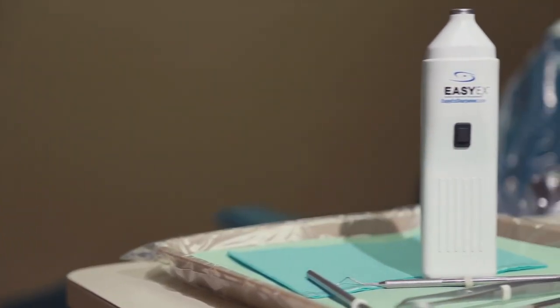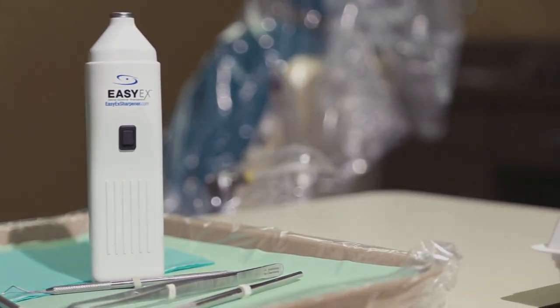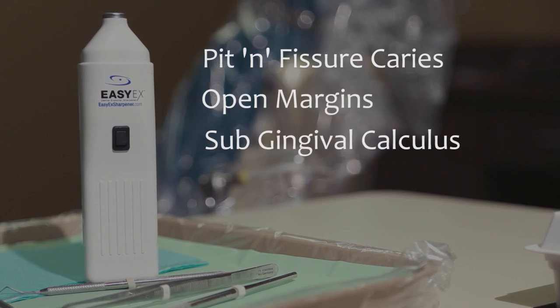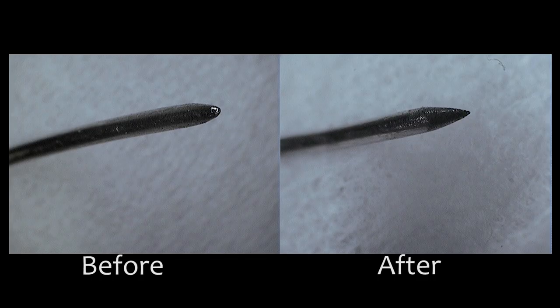As practitioners, we know that a sharp explorer is much more effective at diagnosing pit and fissure caries, open margins, as well as detecting subgingival calculus. Over time, our explorers lose their surgical sharp tip and sharpening them becomes time consuming.